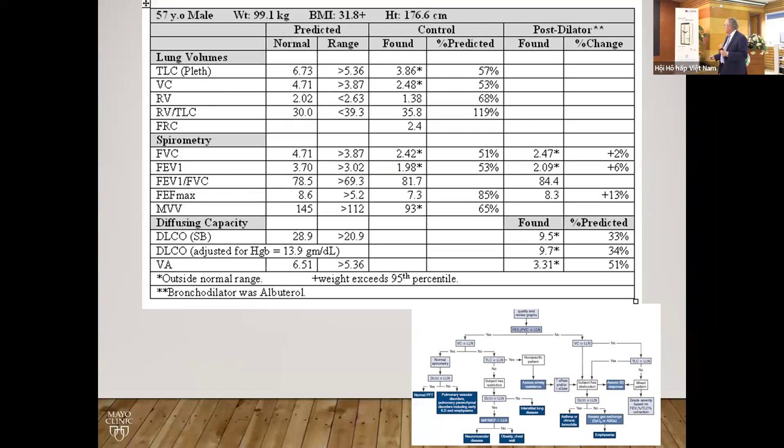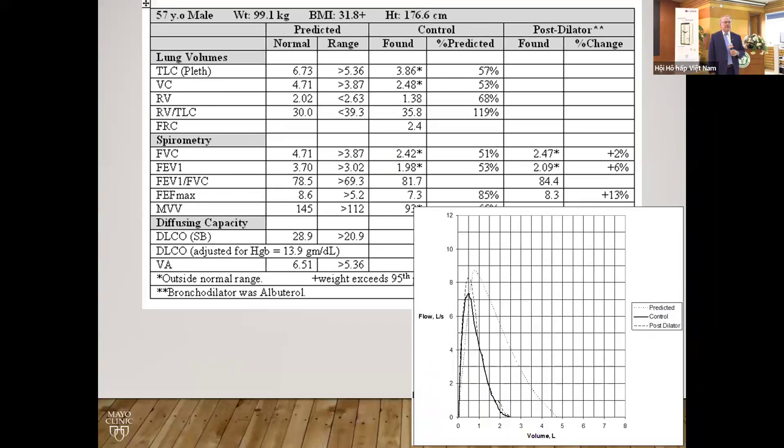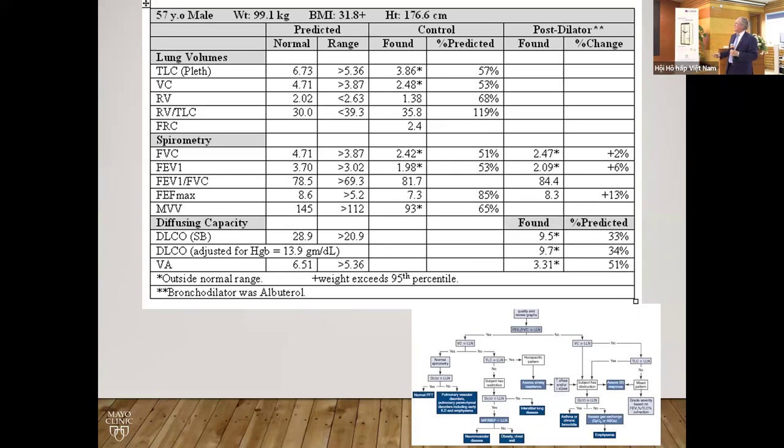So the initial graph hugs the y-axis, has a peak, goes to baseline without artifact, and goes all the way to baseline. So from a quality perspective, from a single maneuver, not seeing all of them, but from a single maneuver, it looks acceptable. You want to start there, or should I wait until the end? Okay, just go, and I will summarize. Okay. All righty. So the very first thing we look at is the ratio.